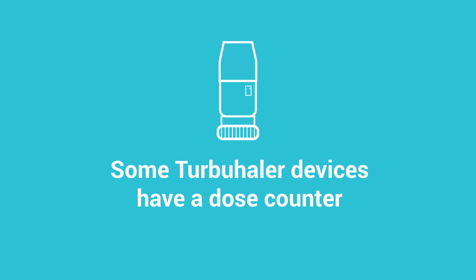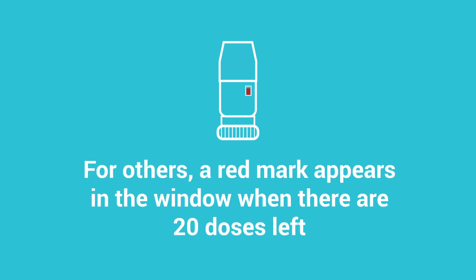Some Turbuhaler devices have a dose counter. For others, a red mark appears in the window when there are 20 doses left.